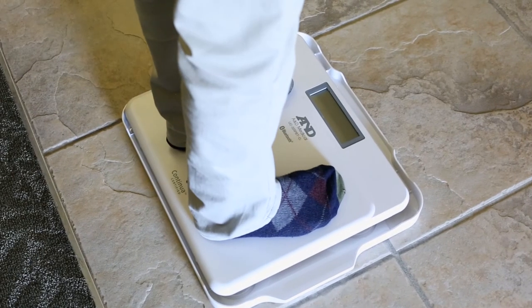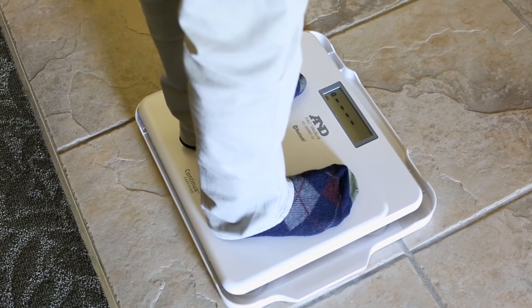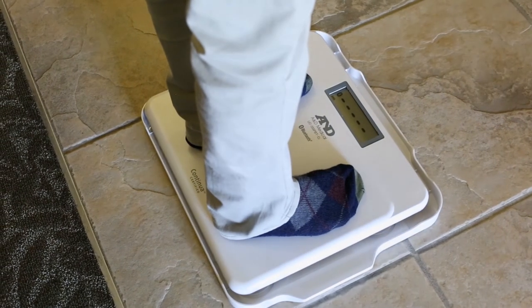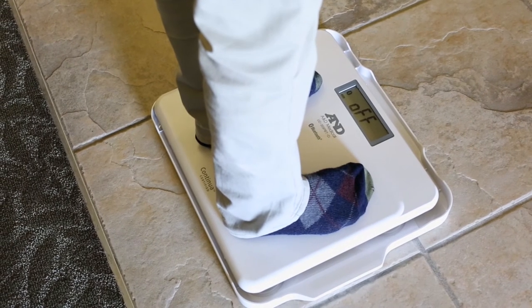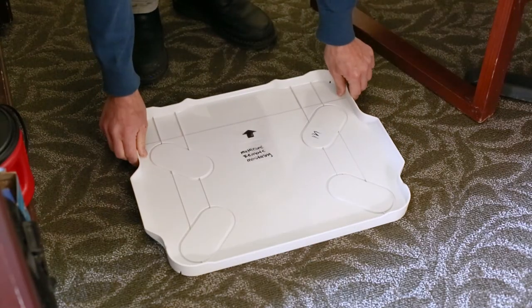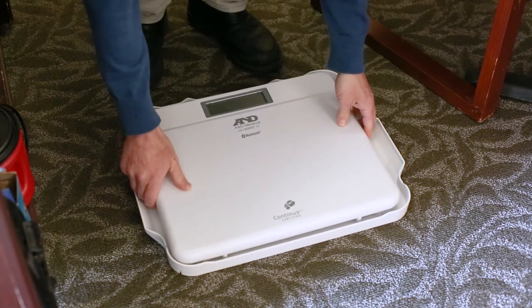Scales should always remain flat on the floor on a hard surface. If your scale came with a tray, please pay attention to the orientation arrows of the tray so that it is set up properly. Arrows should be pointed away from you with the screen of the scale facing the same direction.